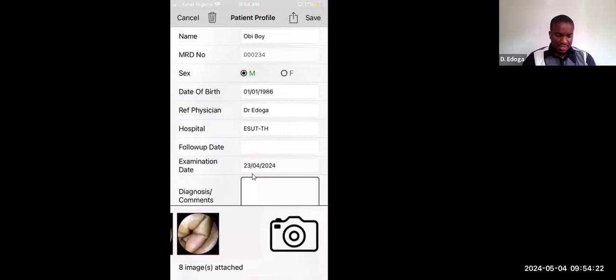But if you want to image on the patient after filling details, you just click on the M2 Red Cam. So you click on M2 Red Cam. See, there is autofocus and the mask is already applied. This is one advantage of this app.